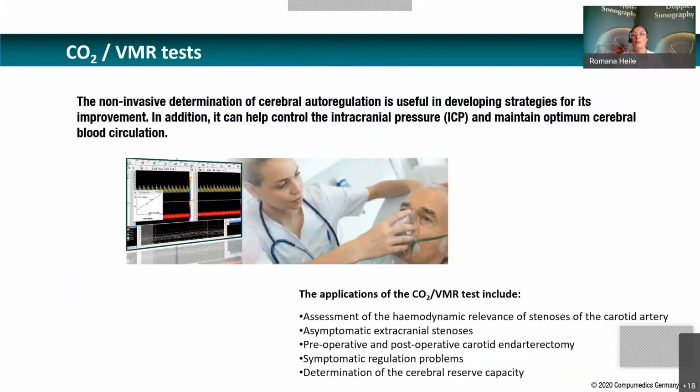So when to use the CO2 vasomotoric test procedure? There are many good reasons: pre-surgery cases, during surgery you can look for reserve capacity, but also afterwards to see if the patient has benefited from treatment. Seeing this presentation, I hope you can see that it's not so difficult to do. All you need to do is to know how the test goes and in which way to perform it. So everything is simple if we know how to do it.